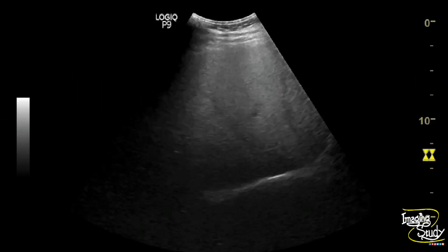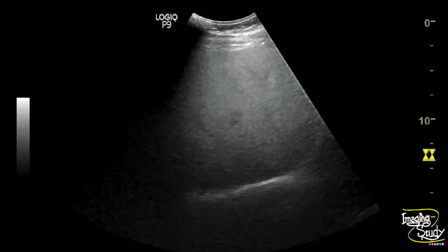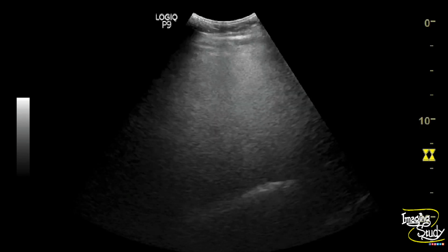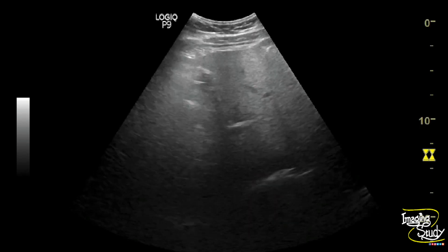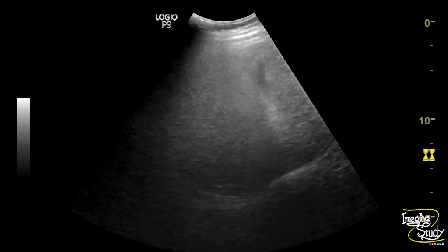Here you can see the right lobe of the liver showing increased echogenicity, but the picture looks quite hazy due to increased sound attenuation by the hepatic parenchymal fat.